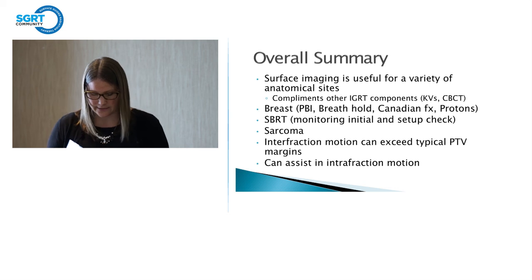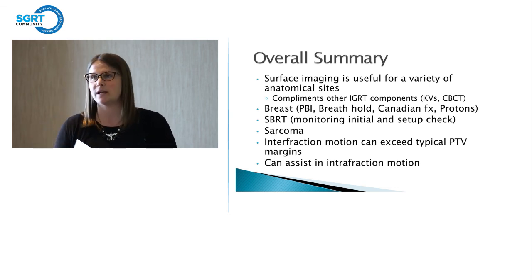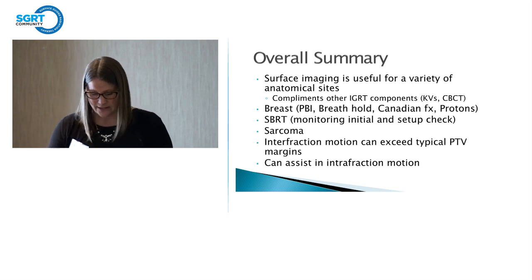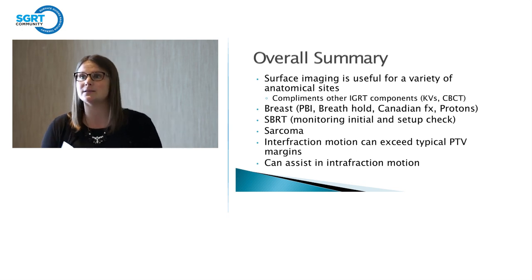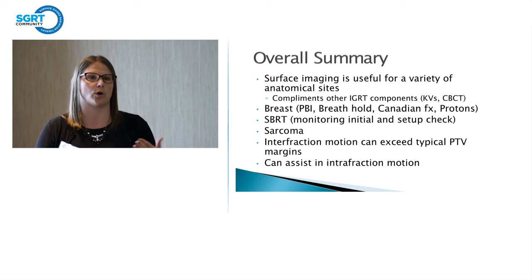We have treated 79 sarcoma patients using SGRT since 2013. And we really think that it has been able to increase our accuracy and our throughput. We were able to reduce our treatment appointment times from 20 minutes to 15 minutes using this technique. It really cuts down the amount of time, not having to cone beam every single day.